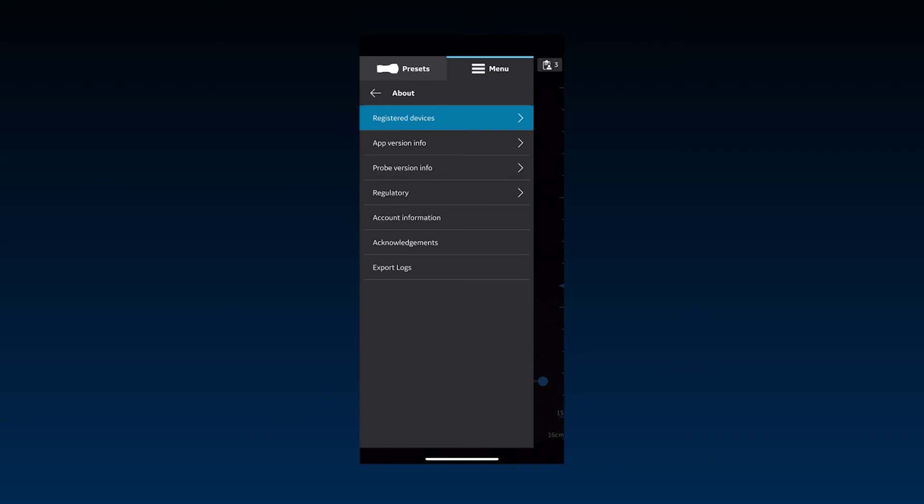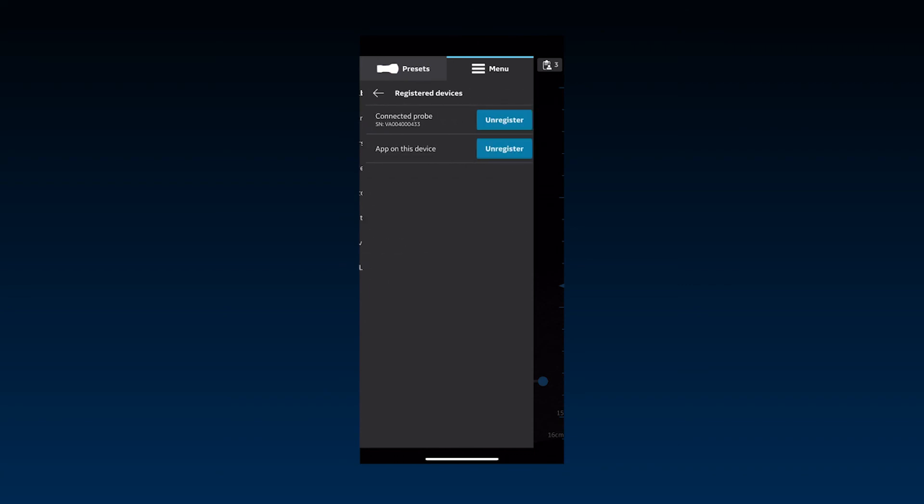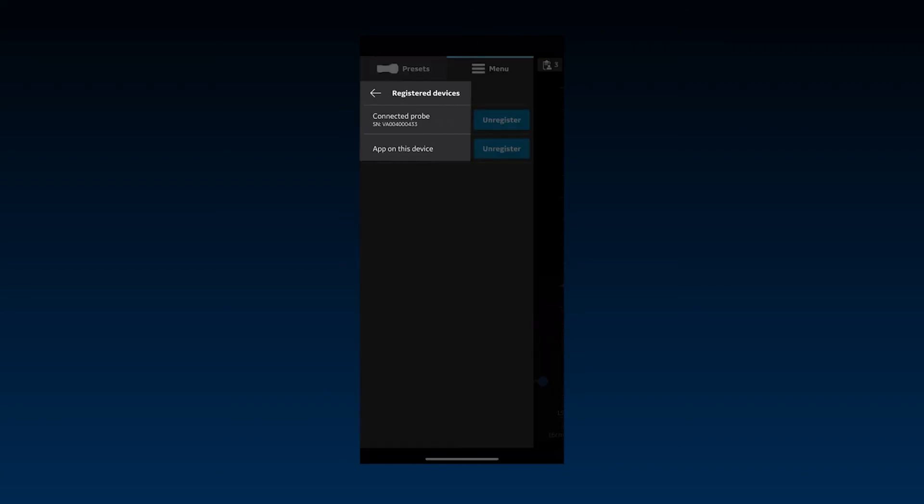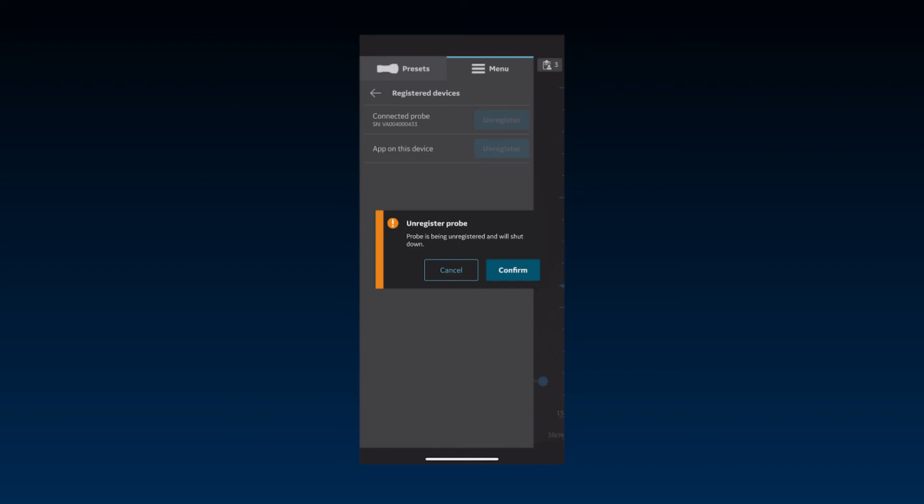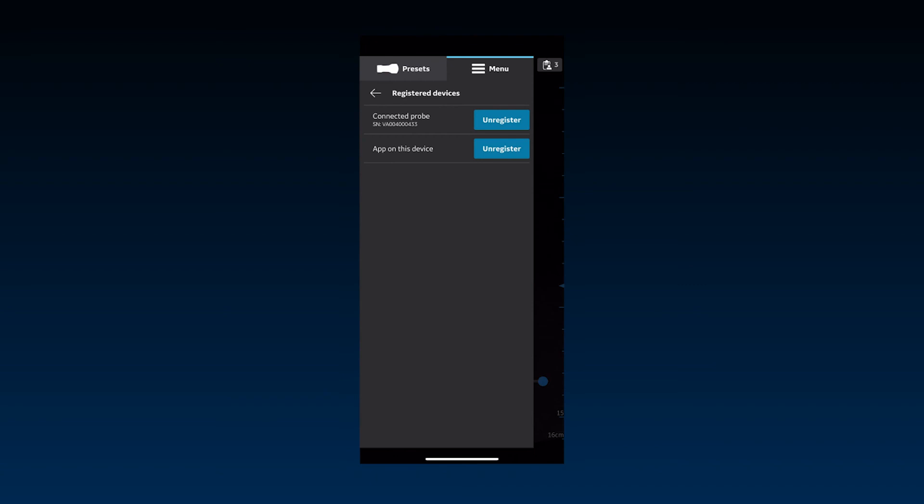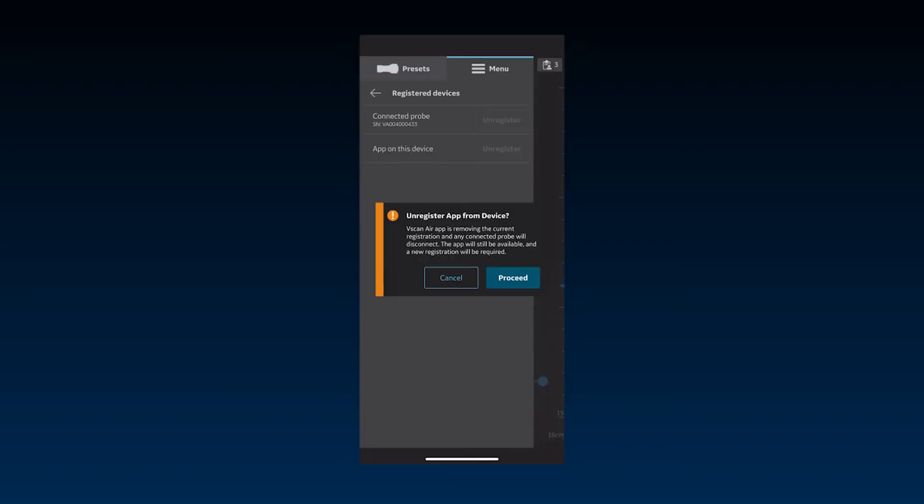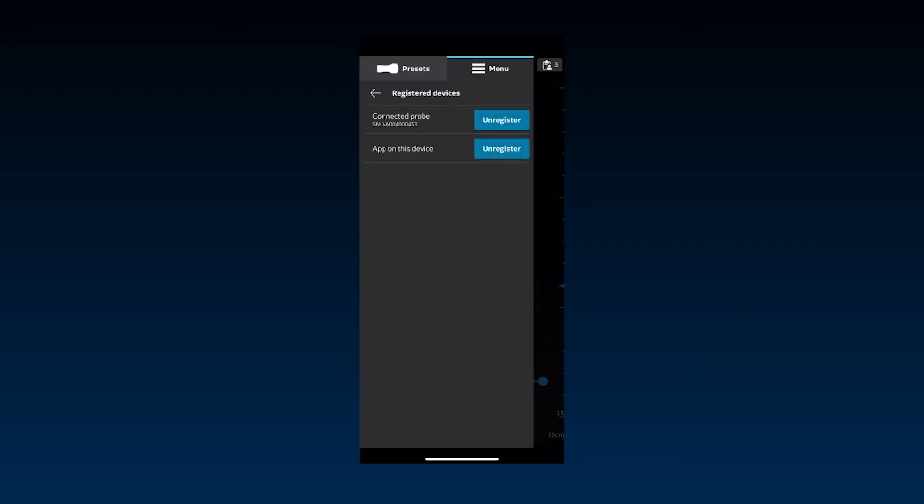Under Registered Devices, you can see the connected probe and app on the display device. It's possible to unregister the probe and app from here. Simply go to Registered Device and select Unregister. Note that patient data is deleted if the app is unregistered. You will need to confirm a pop-up notification stating this before proceeding with unregistering the app.